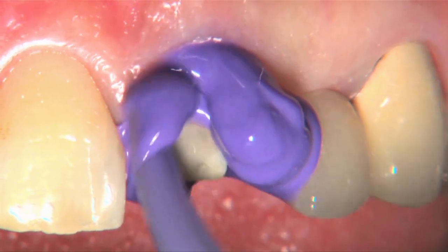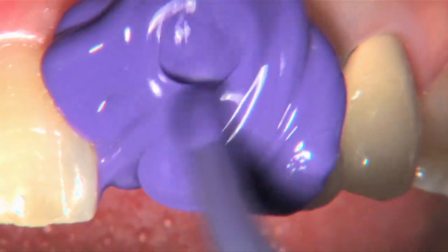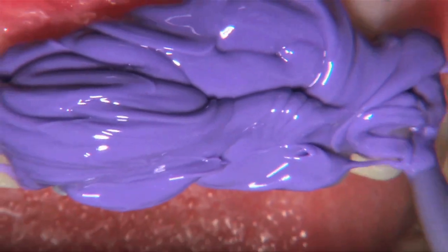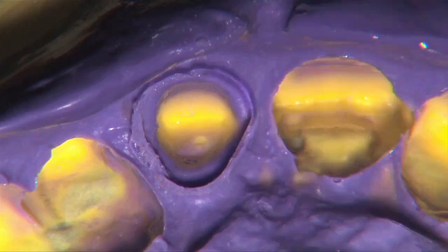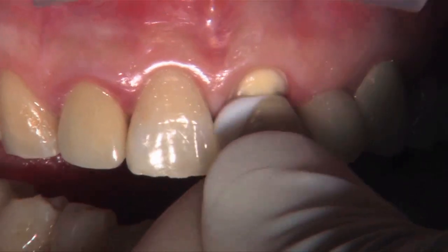So I go around 6 or 7 times, that's probably a few too many times, but going around enough times, and my assistant fills the tray, a second assistant fills the tray, hands it to me, place it in the mouth. Patient bites down for 4 minutes, impression comes out, and we see a nice ring of impression material beyond the margin, and that's really what we want to see. That's the key, is that bit of impression material beyond the margin, because that allows our technicians to positively identify where the margin ends.